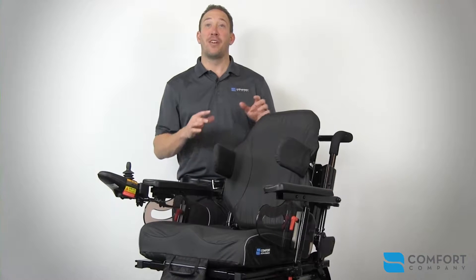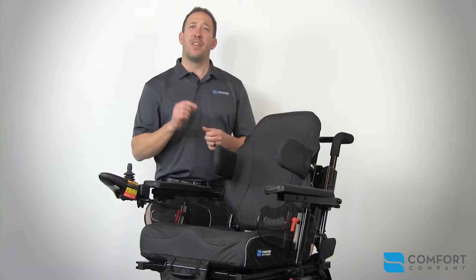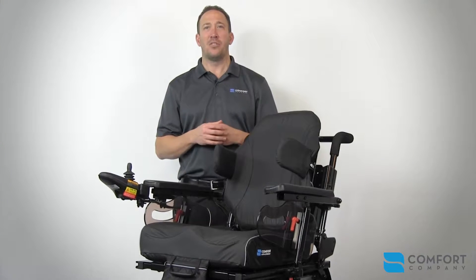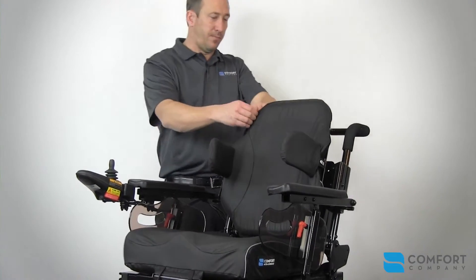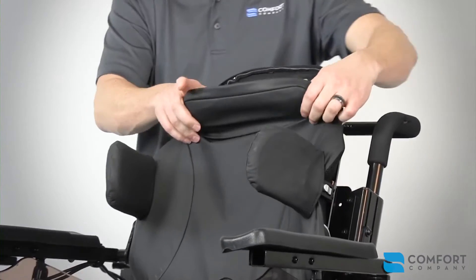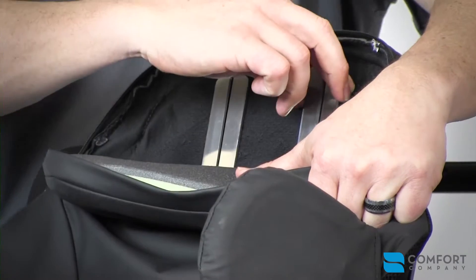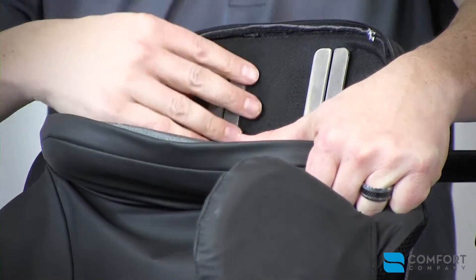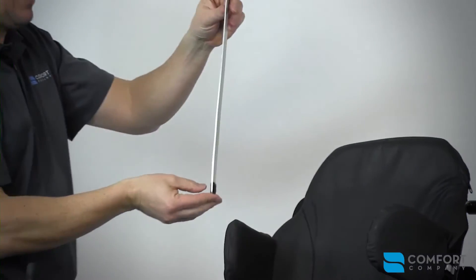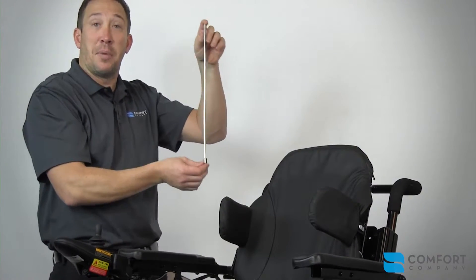The Comfort Company has developed a comprehensive line of back supports. This family of backs is called the Acta Series. One of the defining features of the Acta Back Series utilizes moldable aluminum stays to help position the patient. These stays are located inside the cover, directly behind the foam, in individual pockets — there are four or five of these pockets depending on the width of the back. The aluminum stays are designed to be removed and molded into any configuration necessary to match your patient's seating needs.